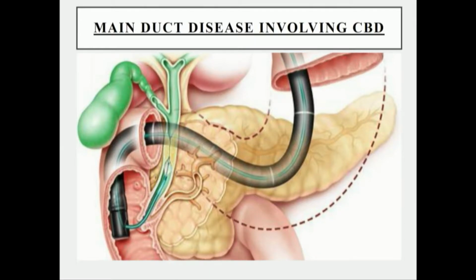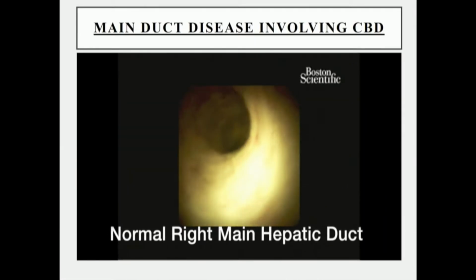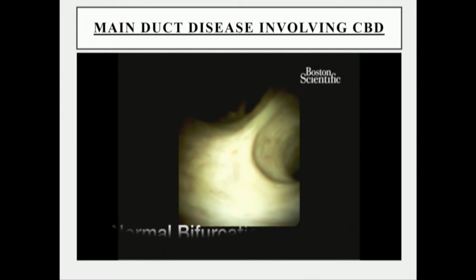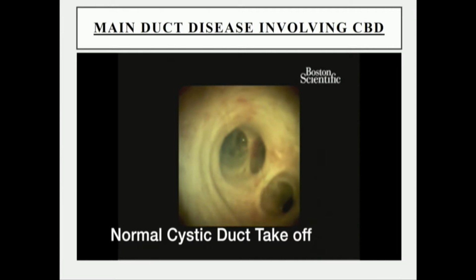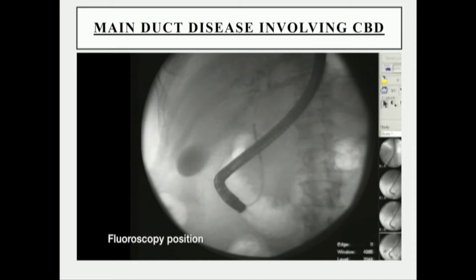What's interesting is this actual example is exactly how our patient is. We have a common bile duct that's been afflicted by disease. And as Dr. Lowe had mentioned to you before, this would then potentially be a Whipple for cure. And it's really important for us to understand where in the bile duct that's affected. Is that the level of the cystic duct, or is it below that, and is it in the intrapancreatic portion?